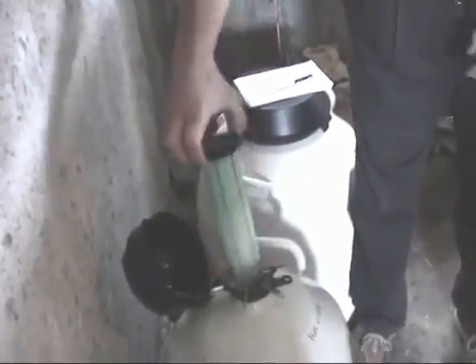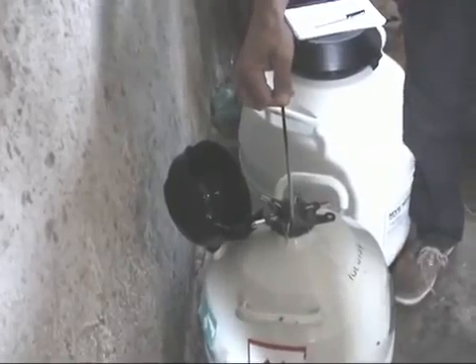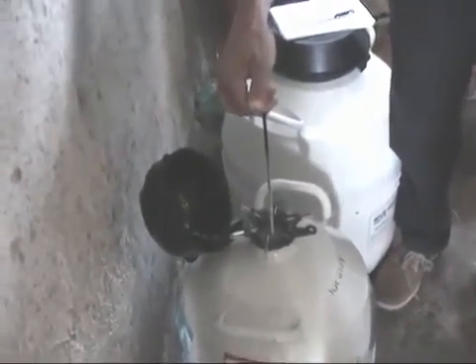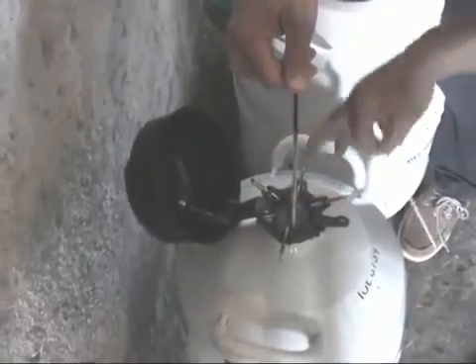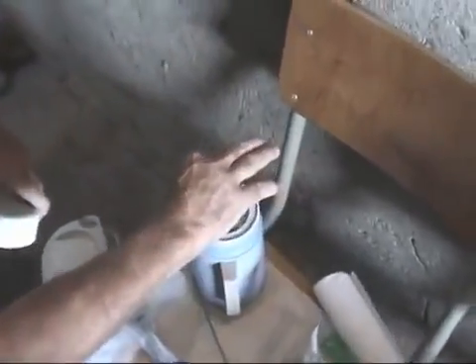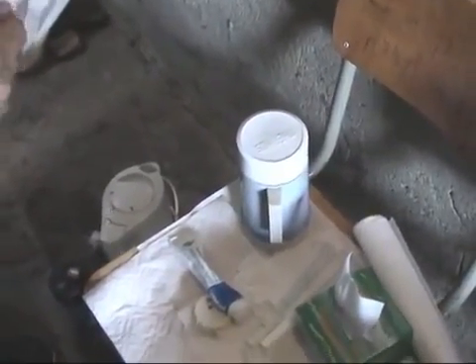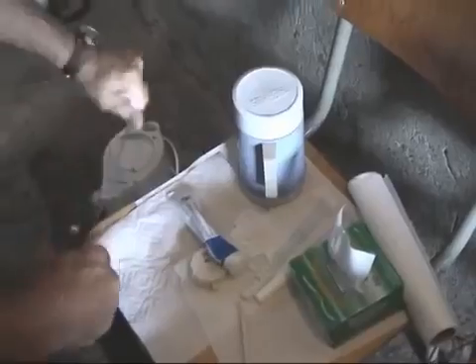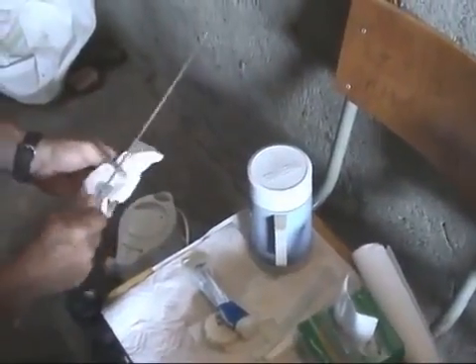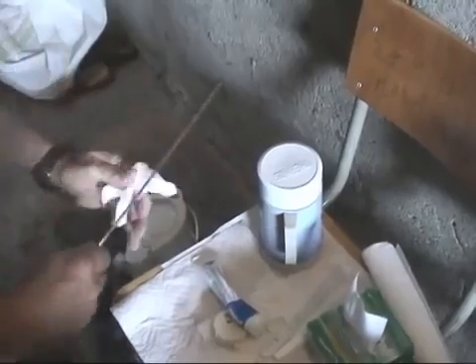Alright, we're now ready to thaw some semen for the doe we examined who's open and ready to be AI'd. We've identified the sire in the tank in one of these canisters and we're ready to pull a straw of semen out. We put them immediately into the thaw jar between 95 and 100 degrees Fahrenheit and leave it there for 15 to 30 seconds. I prepare the AI gun and the sheath for loading. I rub the gun to make sure it's warm, because we want everything that comes in contact with the semen to be about the same temperature — around 95 degrees — so that there's no cold shock to the semen.